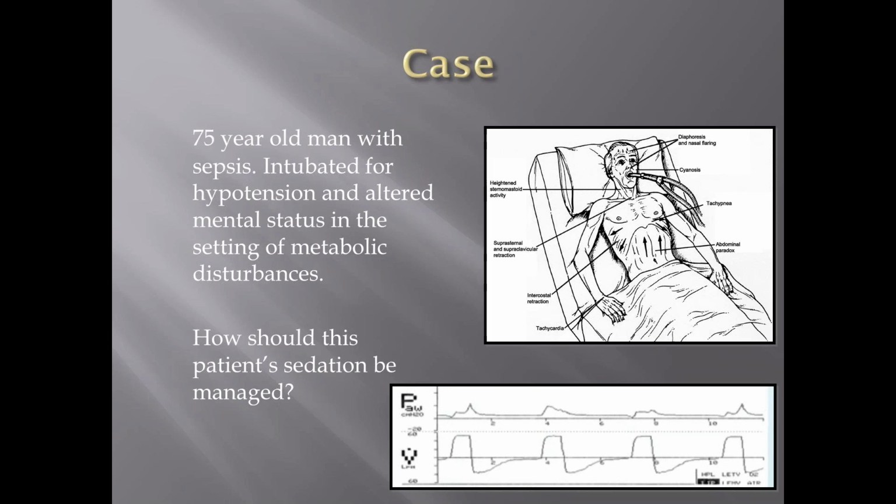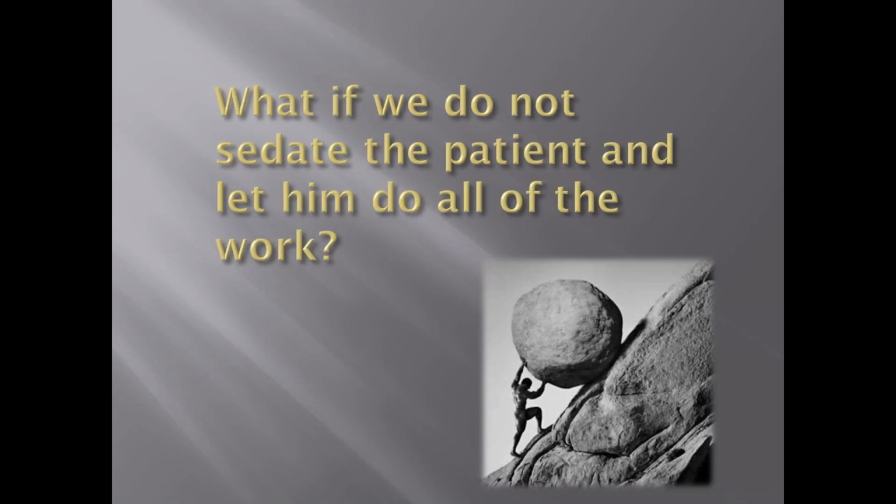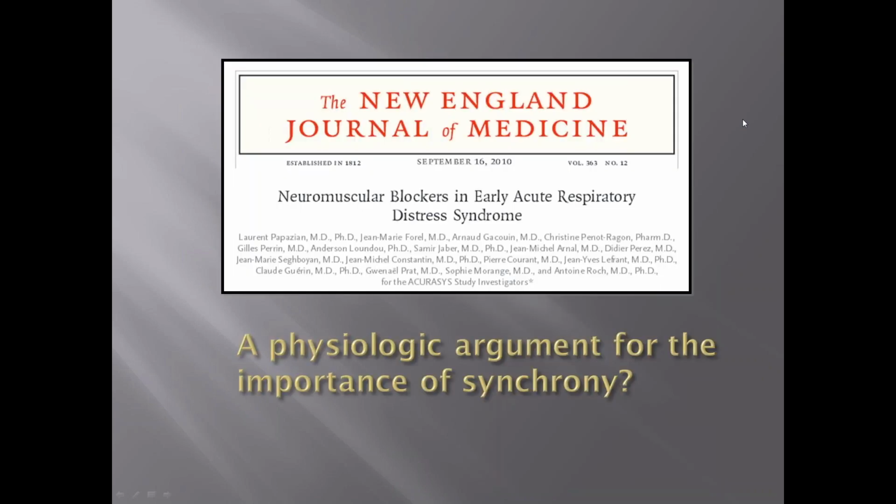Yeah, I think that's the main thing to take away from this, right? That in most ventilator modes, the waveforms should look pretty similar. And in some modes, there's two kinds of waveforms, but it's never like each one is different, right? So when you see that, that's an immediate alarm that there's some sort of dysynchrony or something's not right with the patient or the ventilator. All right. So what if with this patient, we let him just do all the work?